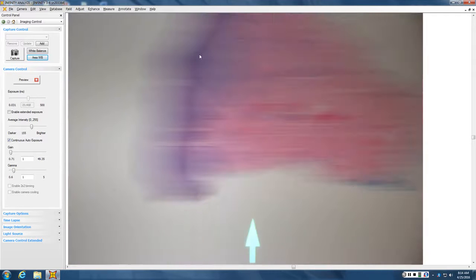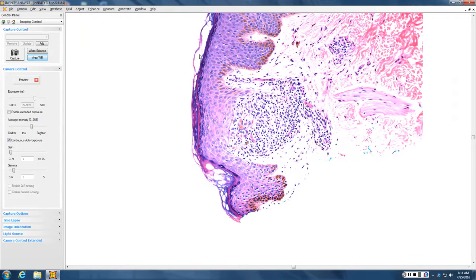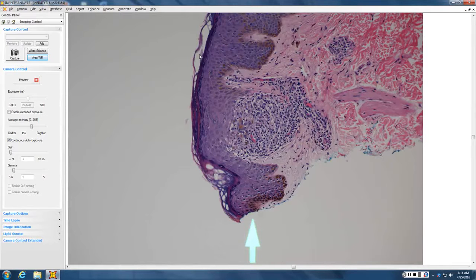Okay. So it looks like you have these nested cells. You appear sort of nested, with a slight lichenoid infiltrate as well. Yeah, so it kind of hugs the epithelium like a lichen of some kind. Is this a big broad lichen or a tiny little dot-like lichen? Tiny little dot-like. Can you think of any tiny little dot-like lichen?